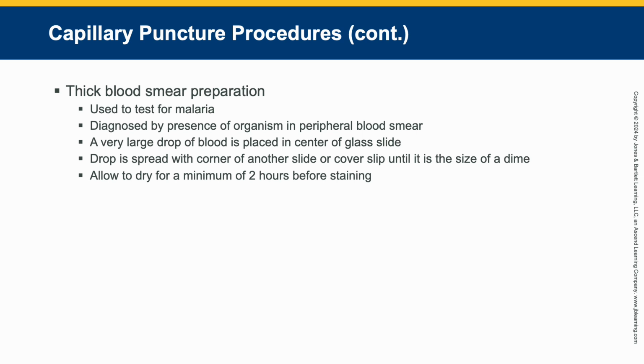So these may be ordered stat or at timed intervals and are most commonly collected just before the onset of fever and chills. Because if the patient comes in and they've had fever and chills, usually it comes in waves. Like they'll get fever, it goes away. Fever again, it goes away. So this collection is done between those bouts of fever.